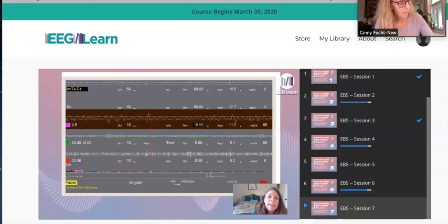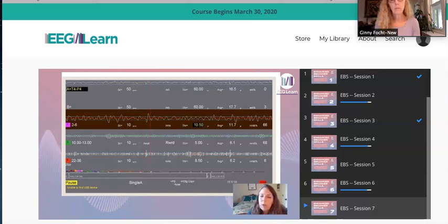So this is a 10 to 13 hertz reward. Hopefully it's in this person's alpha range. They might have a slightly faster idling speed, but hopefully it's the sweet spot for their brain. And if alpha is the balance point between inner and outer focus, and their average amplitude in slow wave activity is way higher than their alpha reward activity, then you can still bet they're stuck inside their head a little too much.